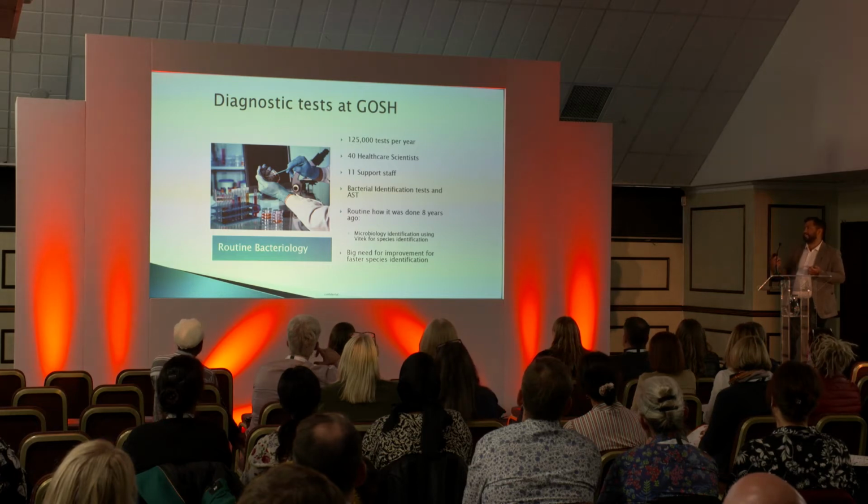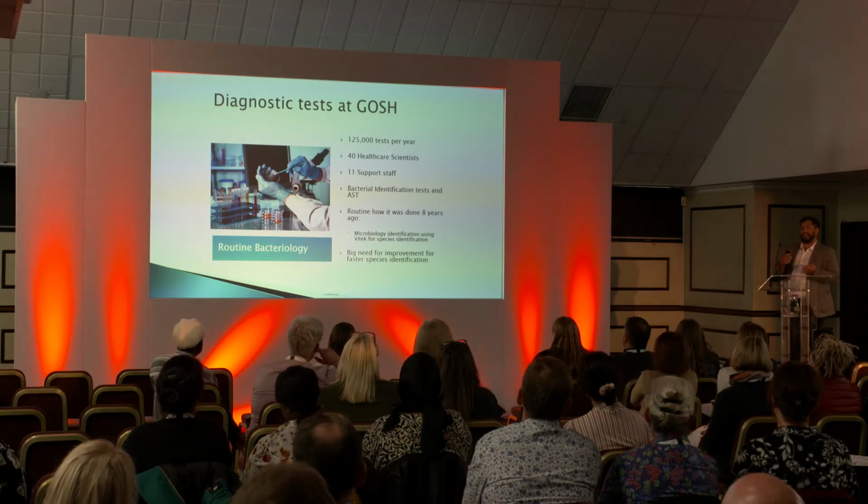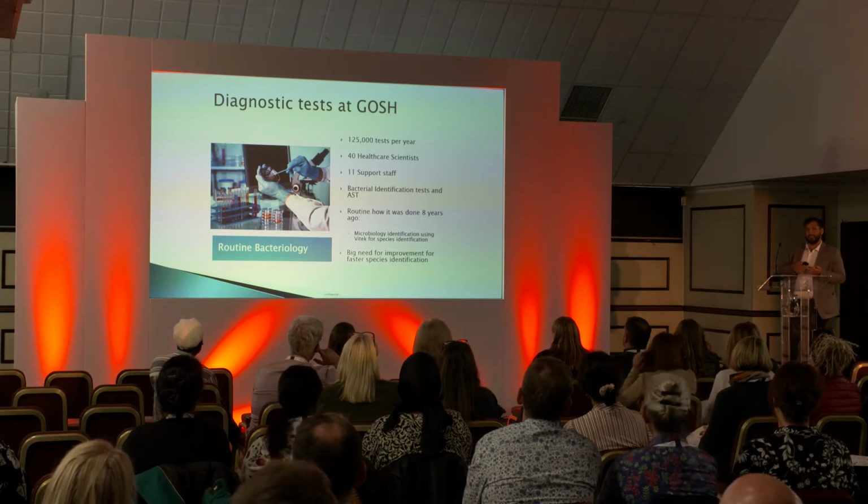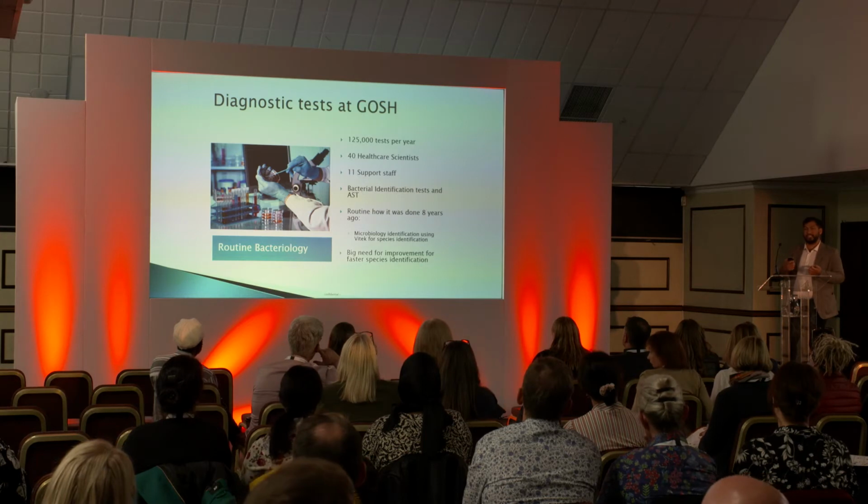In the micro lab, we basically do bacterial identification, so when we find a pathogen that's significant, we ID it, and then we carry out antibiotic sensitivity testing. And that's just so that we can actually report to the clinicians, to pharmacies, so they actually know what they want to treat with, what's appropriate.